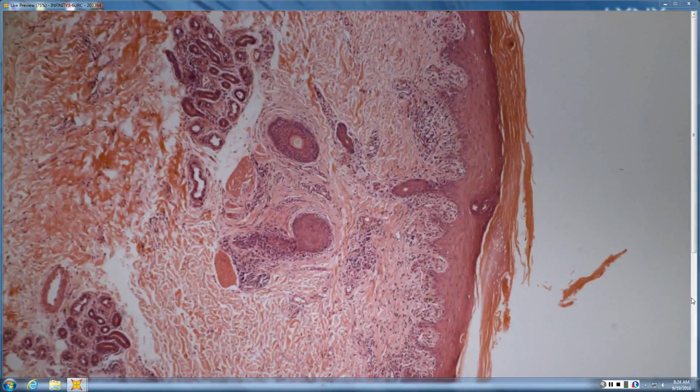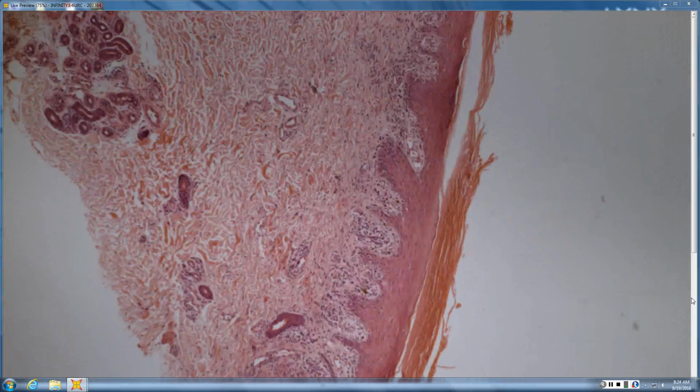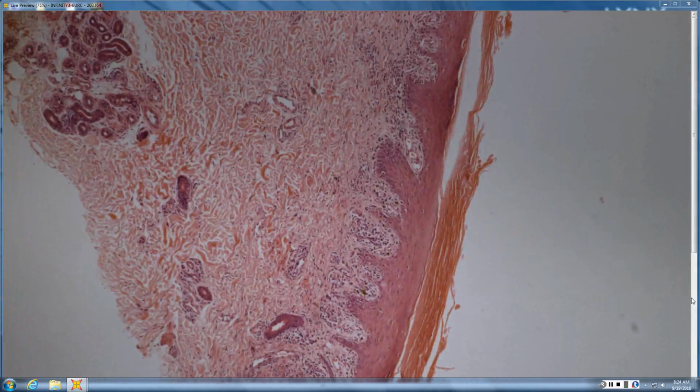So you have a pretty compact stratum corneum, nice sawtoothy lichenoid. So it looks lichenoid. What are all these dark things up here? Parakeratosis. So what lichenoid thing is this probably not? So it's probably not lichen planus. Probably not lichen planus. And this one was lichenoid drug.